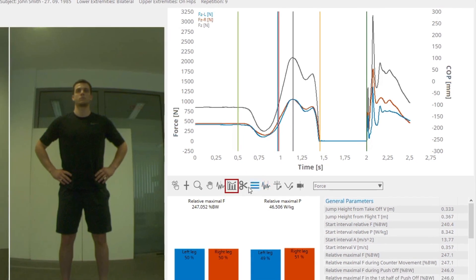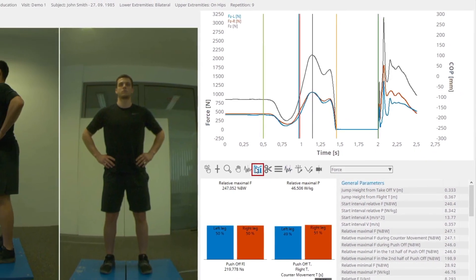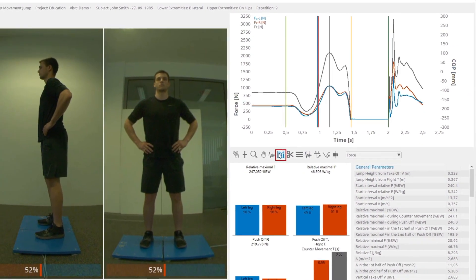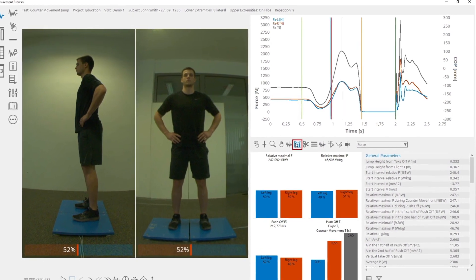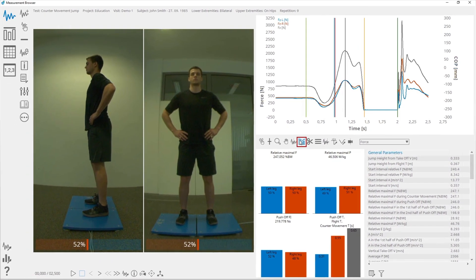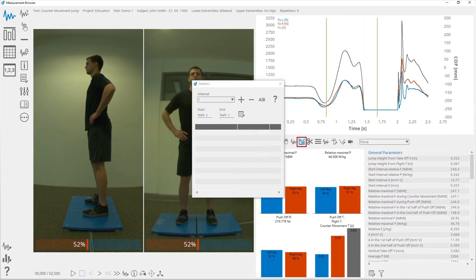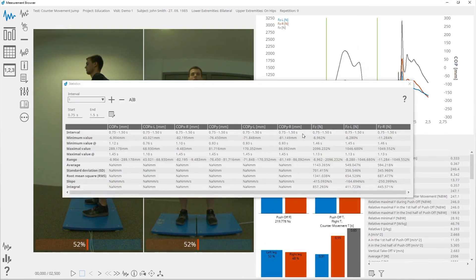Statistics will calculate the basic parameters for each plot on the interval between two cursors.